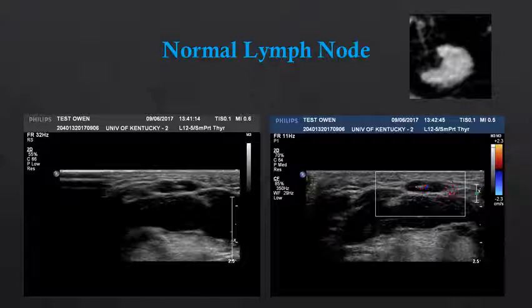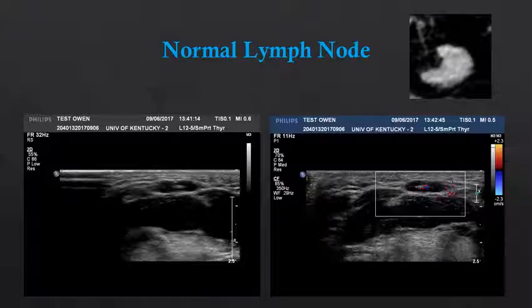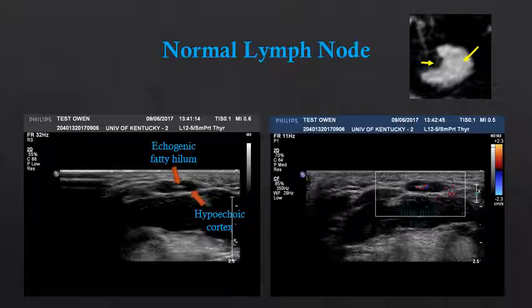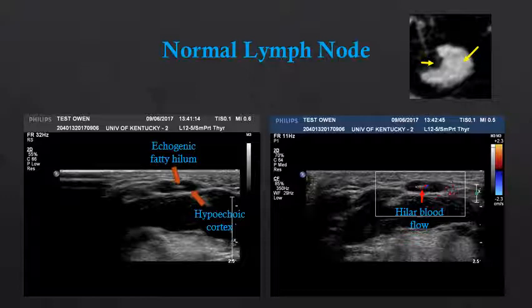Let's take another look at some normal lymph nodes. I've provided a grayscale image of a normal lymph node, a color Doppler image of a normal lymph node, and a normal lymph node on CT for correlation in the right upper hand corner. You can see the hypoechoic cortex of the lymph node, and in the center we see an echogenic fatty hilum. On the color Doppler image, we can see blood flow emanating in that central echogenic fatty hilum.